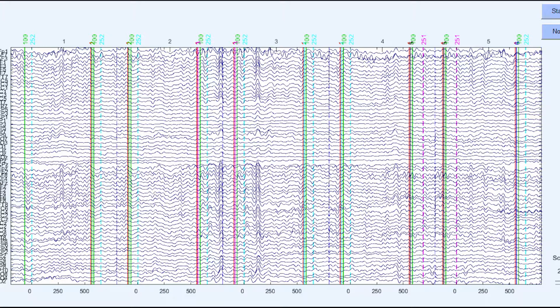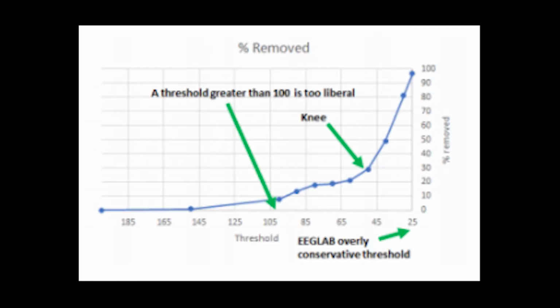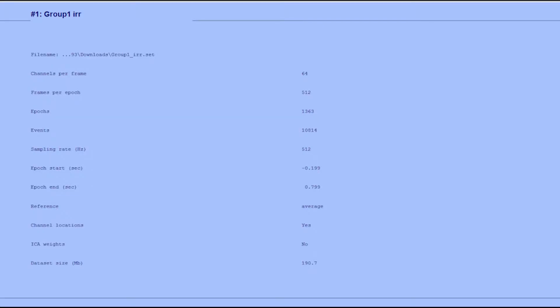we are able to delve further into artifacts and remove these. Asking EEG Lab to reject data seems to be an effective way of doing this. The following dataset displays rejected data through marking them in the colour green. However, in our analysis, we changed the threshold in order to retain some data EEG Lab suggested we reject. We did this with the guidance of this graph. Once completing this process, we found through calculation of our epochs that our dataset was made up of 17.8% of relevant stimuli.